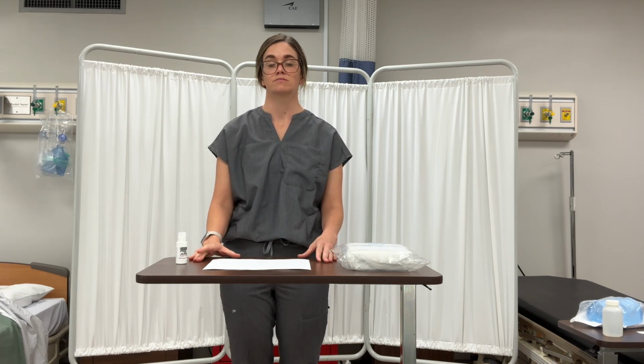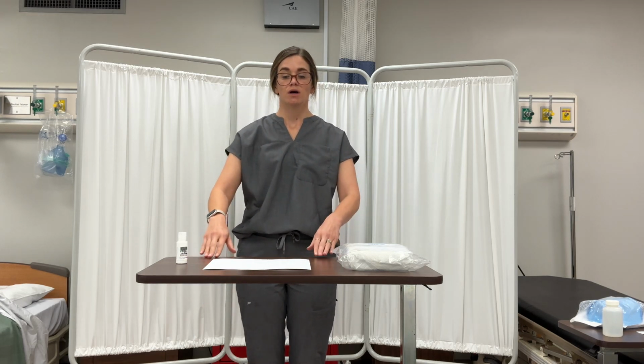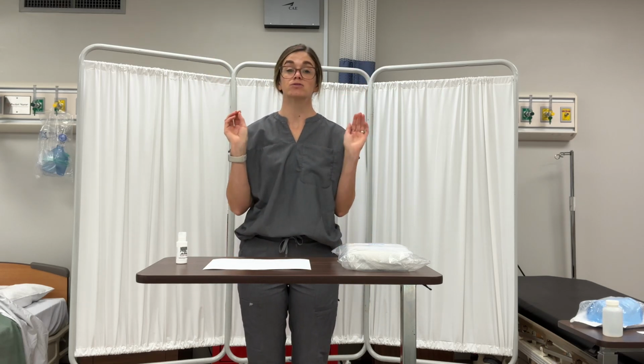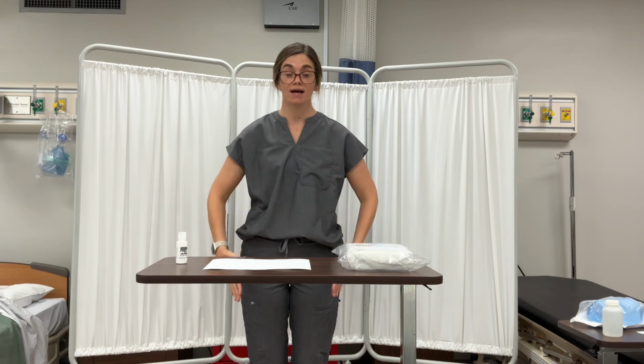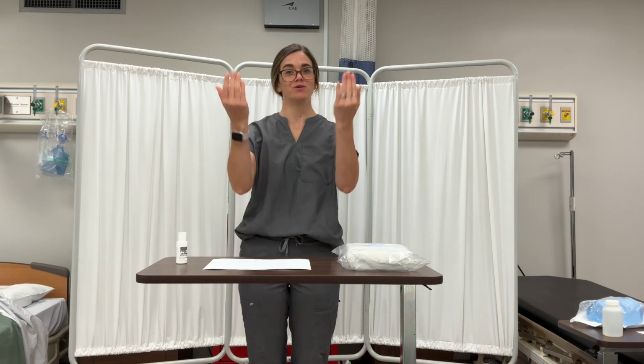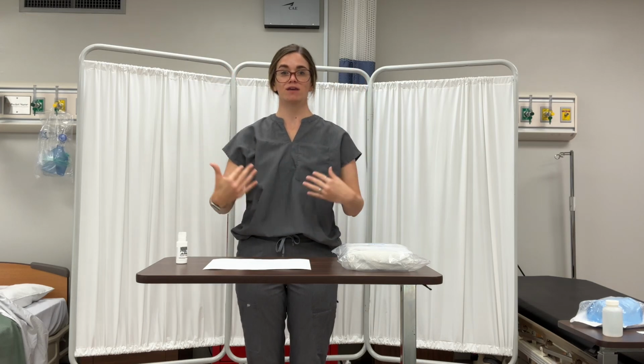A sterile object or field out of the range of vision or an object held below a person's waist is contaminated. So if I have sterile gloves on and I drop my hands below my waist, my hands are no longer sterile. Everything has to stay above the waist. If you've already watched our sterile glove video, you know I hold my hands like this, everything above.